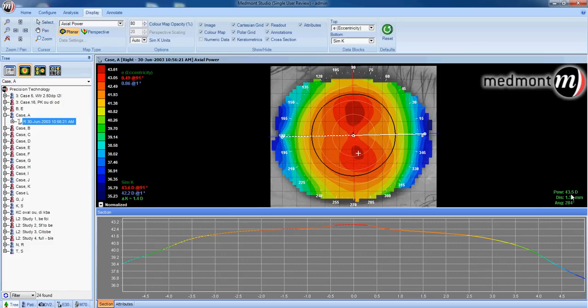43.5, just inferior of the apex. And where the cursor has been clicked, we're 1.30 millimeters away from the center of the topography.